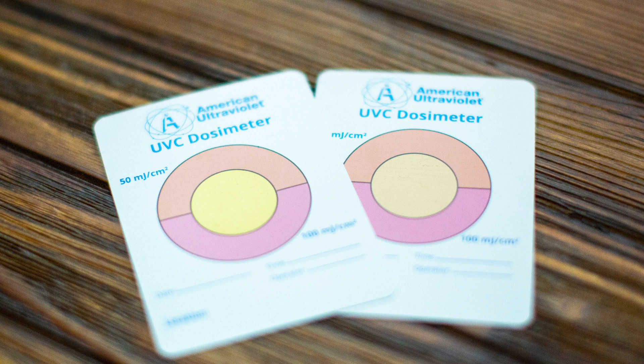What I have here is a card that has a yellow center, and then the top portion is orange and the lower portion is pink. These correspond to different dosages or different levels of ultraviolet being received.